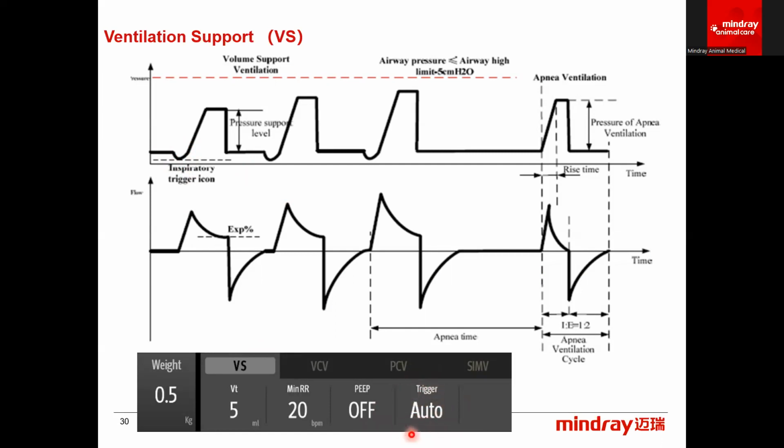It will actually automatically adjust as well if your patient has a respiration rate above 20 and their inspiratory flow is very low. They're taking these puny little shallow breaths. The trigger will start to learn that this patient is taking very poor breaths at a high rate.